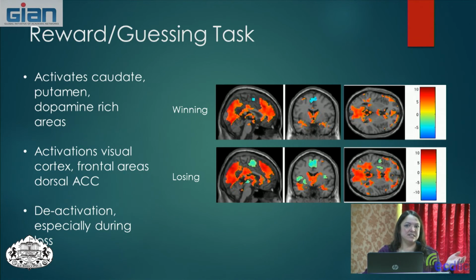Does that make sense? It's still sort of a gray area, and we're not sure what exactly is happening physiologically. We know there's a change in the BOLD signal ratio, to see it drop instead of rise, but like I said, now the physiological explanation is this inhibitory process.